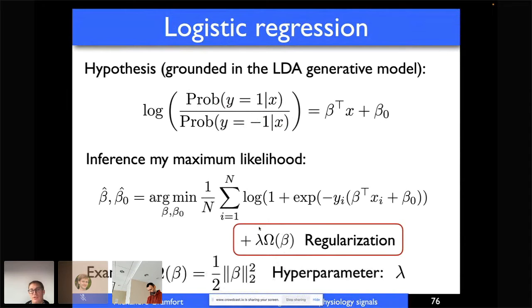Also the important thing to have in mind is that you have a decision here that was made, which is the value of this hyperparameter that can have an impact on your performance.